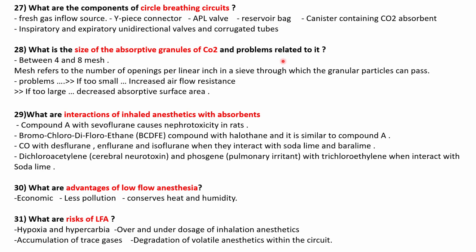4 to 8 mesh. And problems related: mesh is the number of openings per linear inch of the sieve through which granule particles can pass. Problem: if they are too small, airway resistance is high. If they are too large, absorptive surface area decreases.